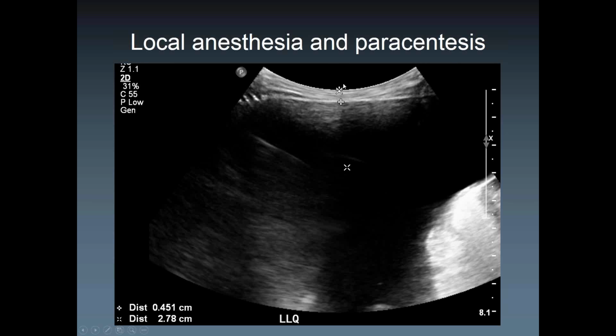So here we basically determined, like in the old days, the skin to peritoneal distance and then the skin to mid-pocket distance if patients were to be done on the floor by the clinical teams. They don't do it in real-time ultrasound, but we mark the skin, and then the team sees this picture and then goes straight in there. So they go like half a centimeter max for sub-Q anesthetics, and then they go in, like in this case, almost 3 centimeters to place the catheter.